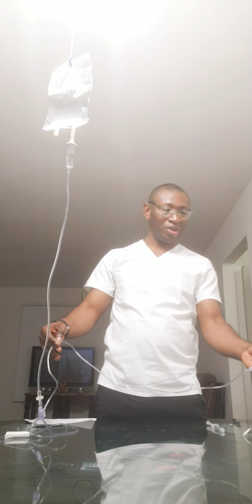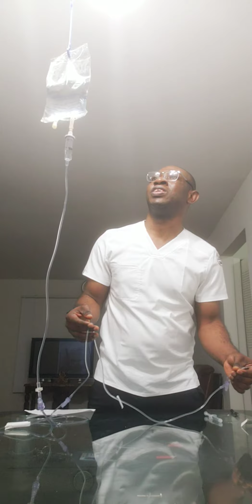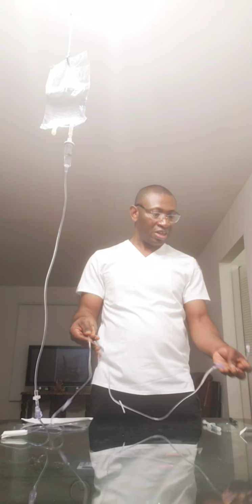Once I remove my needle, I'll monitor the flow and make sure it's flowing at the accurate proportional rate. That's fine, and that's it. When I'm done, I have to do the right documentation: the right dosage, the time, the route, and the time of administration.